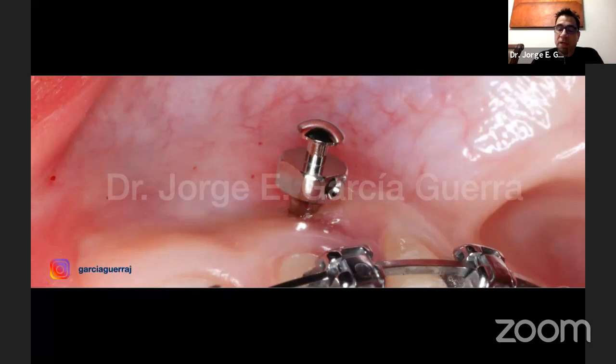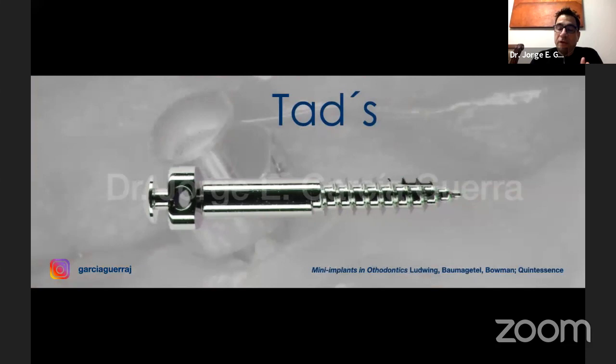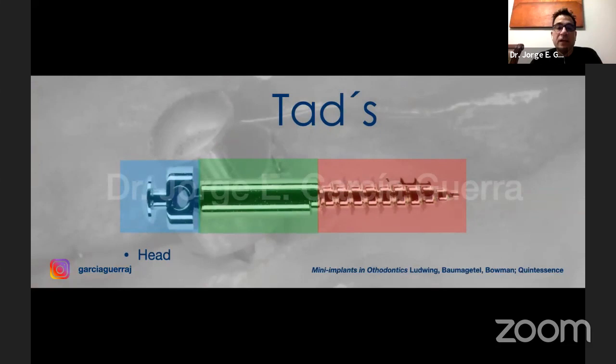Now, we're going to talk a little bit about TADs. The TADs have three principal parts. The first one is the head. This can have a button shape, a little mushroom shape, sometimes a bracket shape, or a hole, like a little slot, as we can see here. Then we have the transmucosal profile.